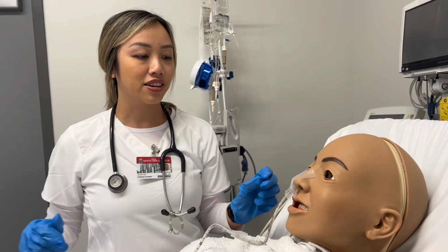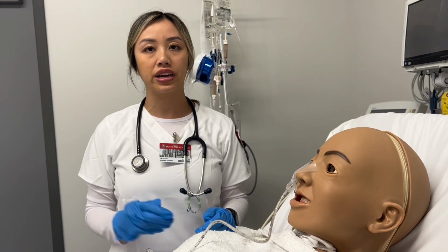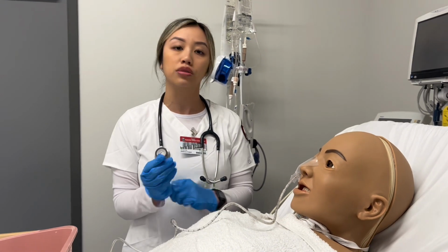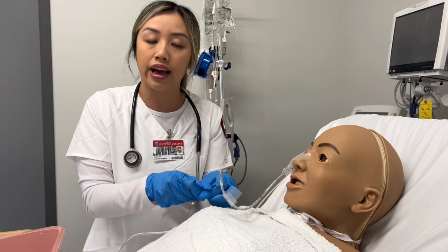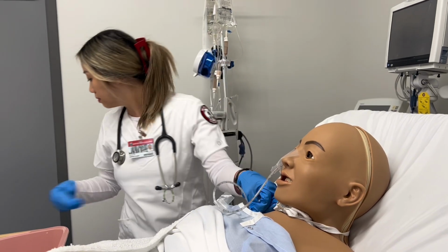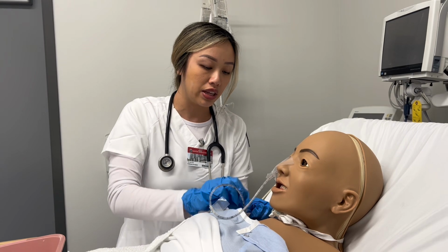Okay, so then I would go ahead and at this time have x-ray come in to confirm the tube placement. So once x-ray has come in to confirm the tube placement, then I would go ahead and attach the tube to the gown. Okay, Mr. Smith, so I'm gonna go ahead and attach this to the gown. I would attach it with a piece of tape and a safety pin.